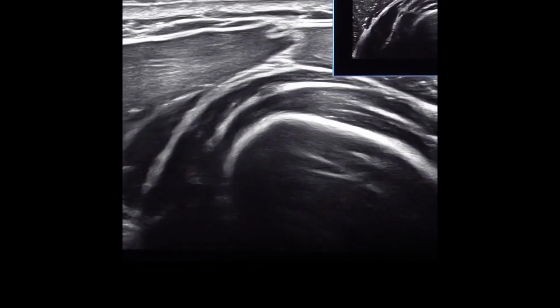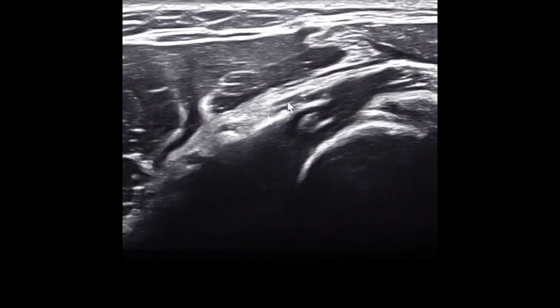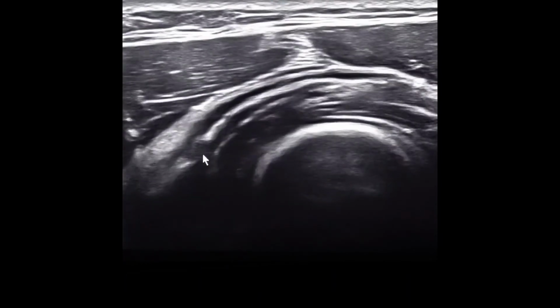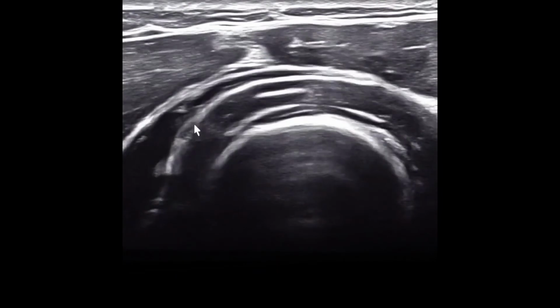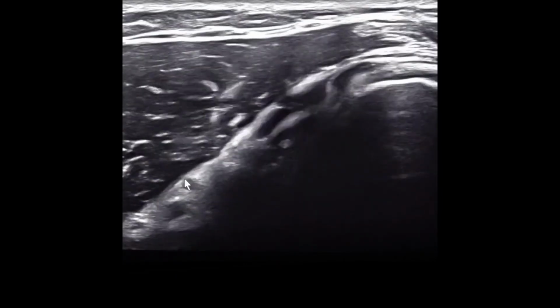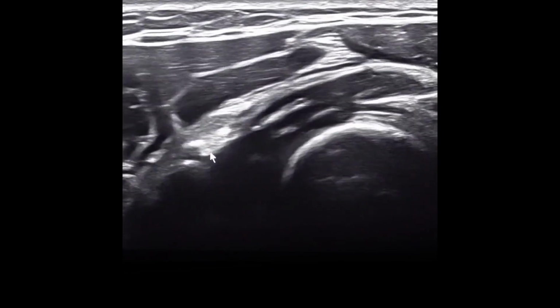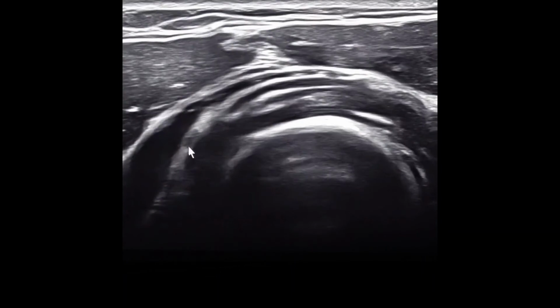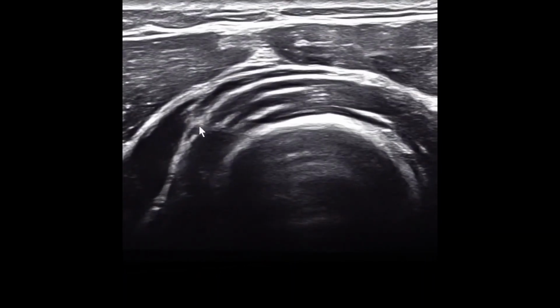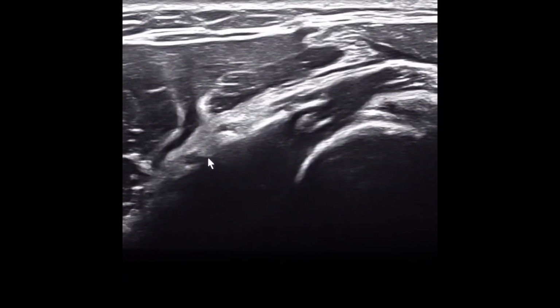But if I go here, where the arcade of Frosch is, it's exactly this fascia here, and the nerve is right there. You could see as it crosses that it becomes smaller here. You can see normal size, and large through here. You see how right there it's large, then it crossed and it's smaller again. So this little eye, like a snake eye here, is normal size, and was normal here, and now it's swollen and big again.